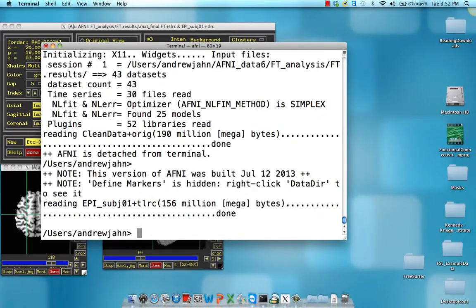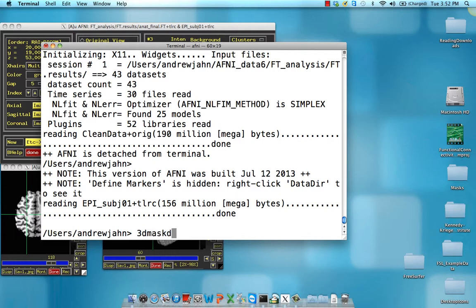So here, what we're going to do is actually extract the time series from that location. We can do that with 3DMaskDump. This extracts data from an underlying voxel.